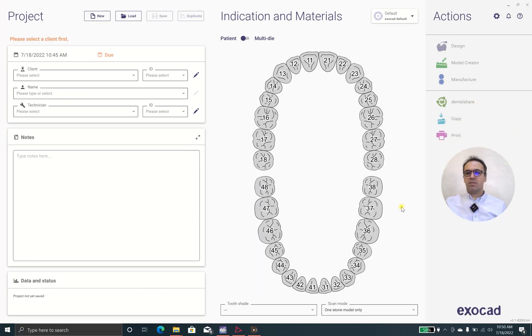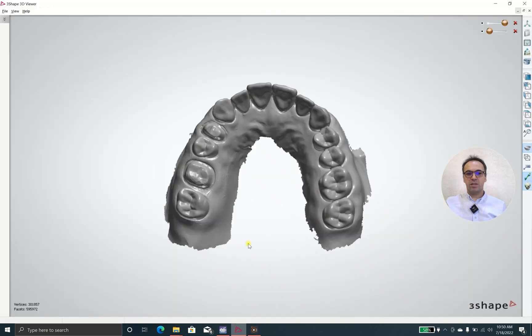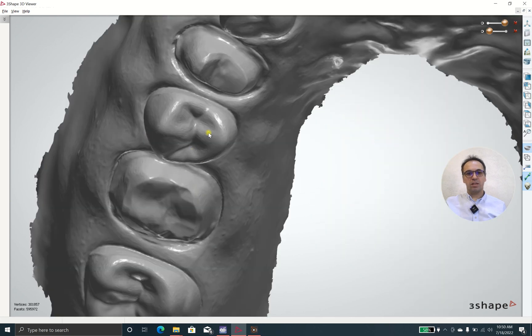Hello everyone, it's Dr. Wafai. I'm going to teach you how to design a 3-unit bridge and how to cut this out.